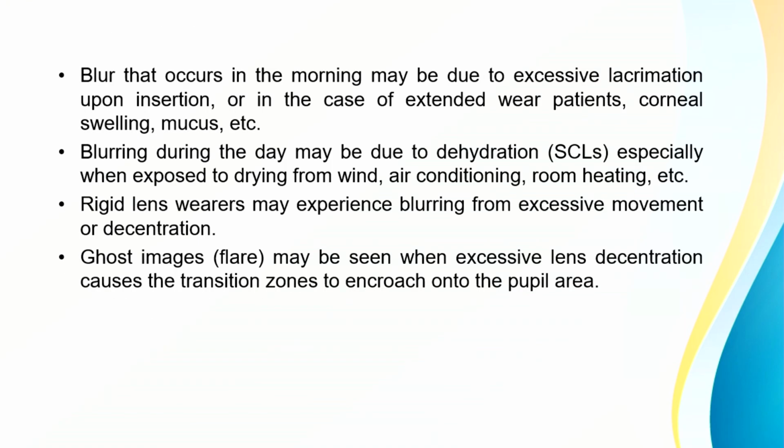I would like to put some light on when the patient will come with blurry vision. Maybe the morning blurry vision which the patient mentions when she or he comes into the clinic will be due to excess lacrimation, where upon insertion the patient will be watering and can tell you about blurry vision, which is pretty much normal in every patient.